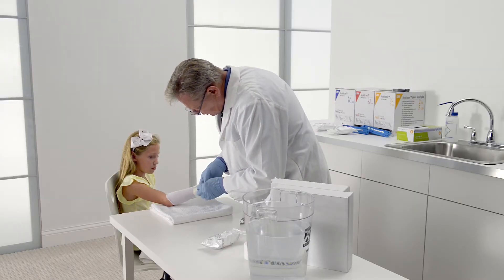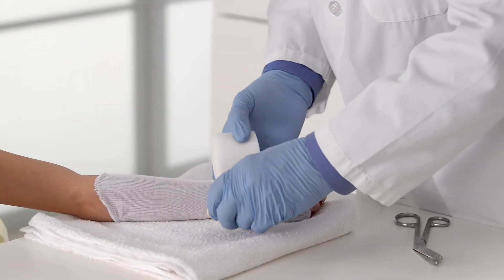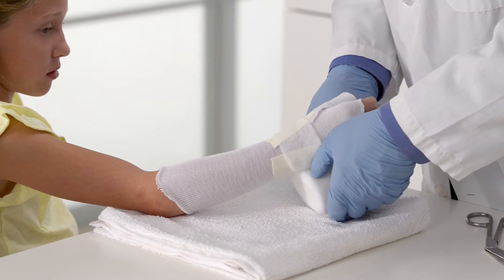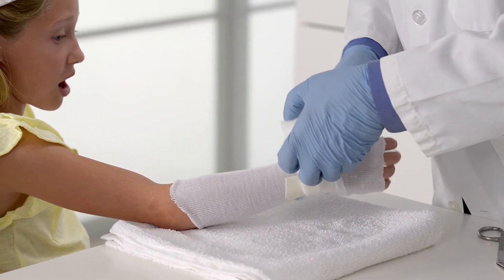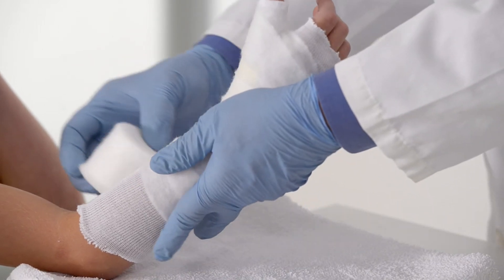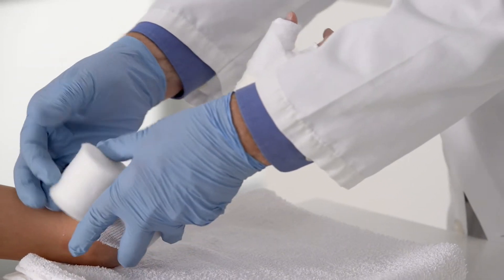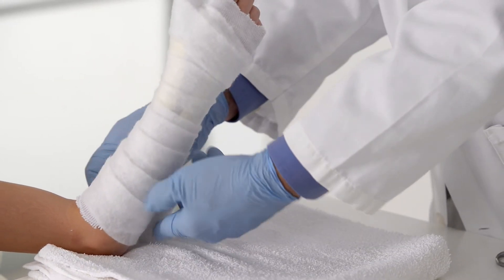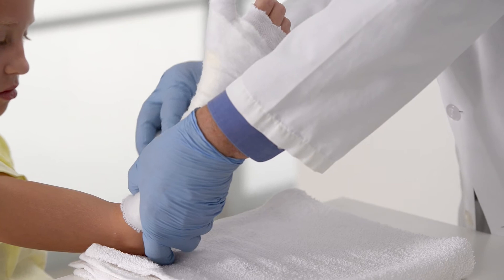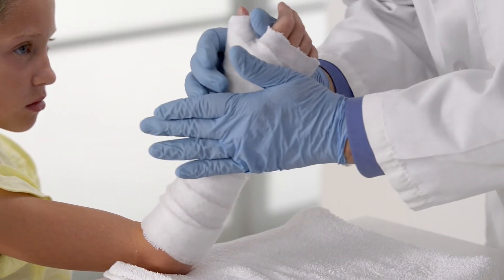Now it's time to apply the padding. Using 3M synthetic cast padding, begin the padding at the wrist, working down to the distal palmar crease. Then wrap proximally, overlapping each preceding layer by 50%. Continue wrapping, stopping 2 finger widths below the forearm crease. Inspect the padding to ensure the extremity is adequately protected. If necessary, add padding to bony parts of the hand or arm.